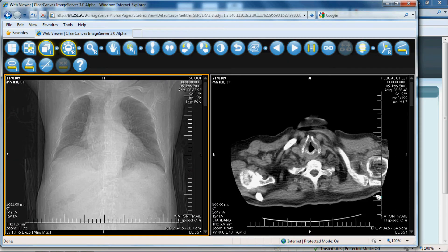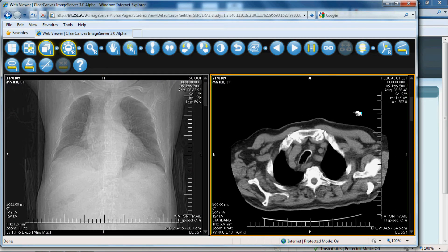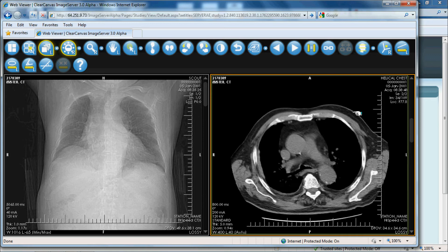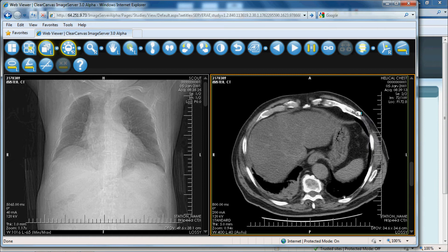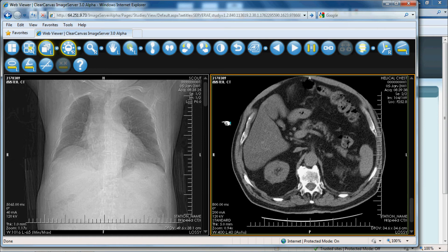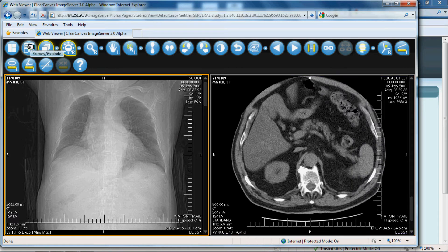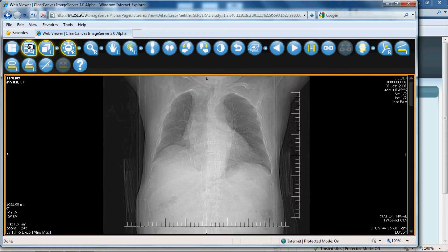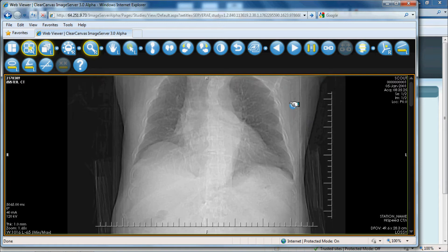The referring physician has the ability to scroll through images and the ability to change the layout. There are multiple tools that they can use — zooming in, pan, and window and level. All the tools needed for a referring physician are at the top of the toolbar.